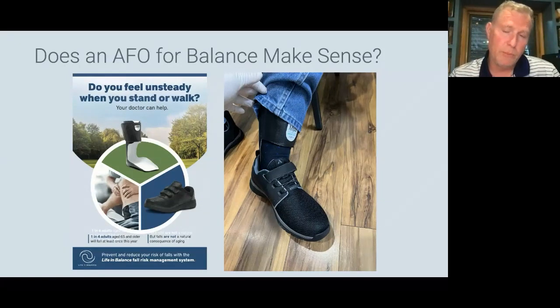And I'll tell you very briefly that what we're trying to accomplish is, in essence, to improve postural stability, which comes from the ankles. It also comes from proprioceptive feedback, which is enhanced by the skin contact we have with the brace in the upper part, the orthosis part. There are lots of studies that validate the fact that we are improving postural stability and sensory feedback by using an orthotic in the form of an AFO. So in essence, we're trying to improve gait and reduce gait deficits, which may include an ataxic gait, an unstable gait. That's what we're trying to accomplish with this device.